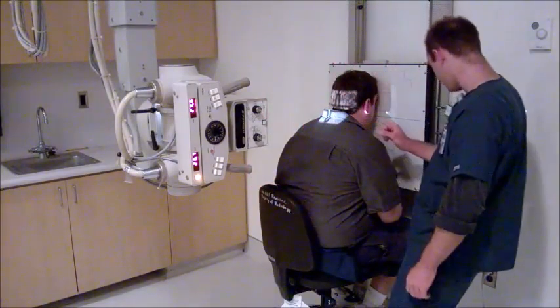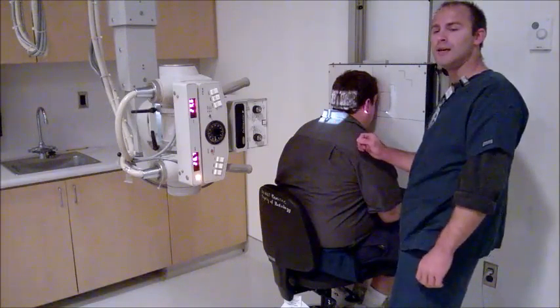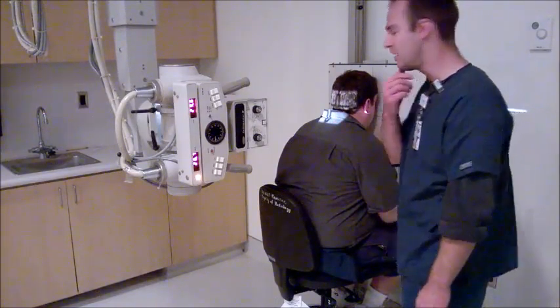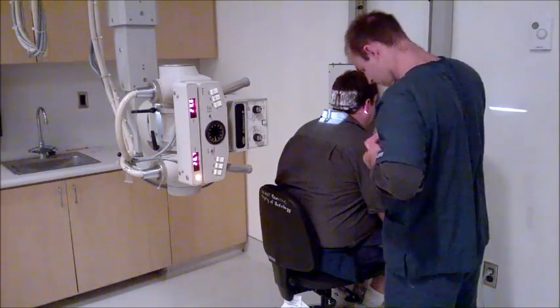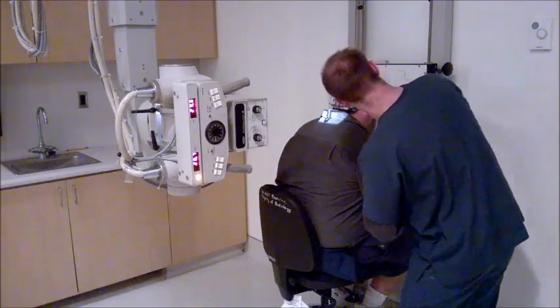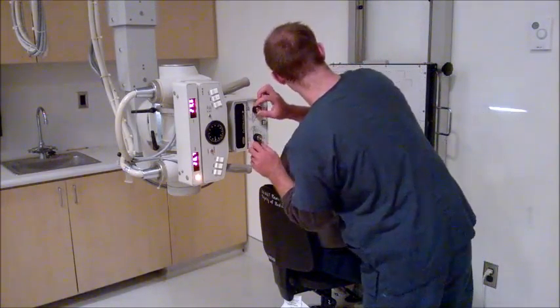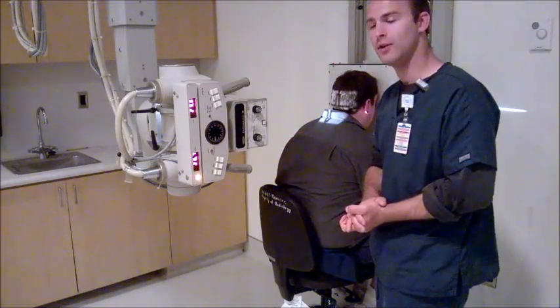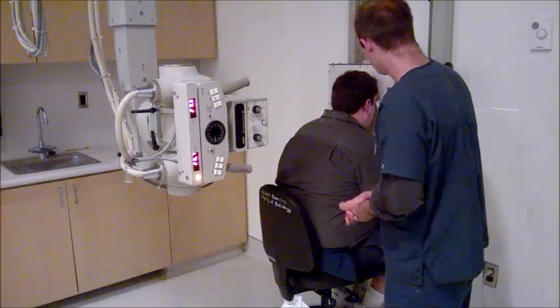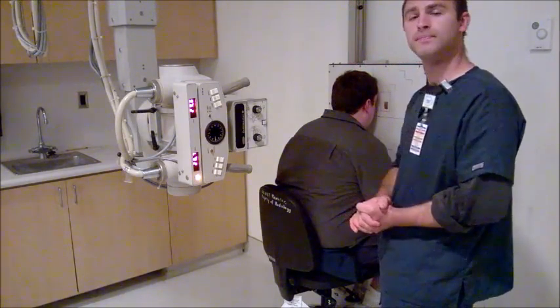Now the CR should exit at the level of the lips because we're doing a PA mandible. So right there, and then place my marker on the right side right there, and then collimate, and it should be 8 by 10 inches collimation. All right, and my technique would be 70 at 20.